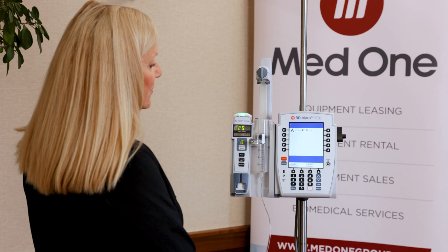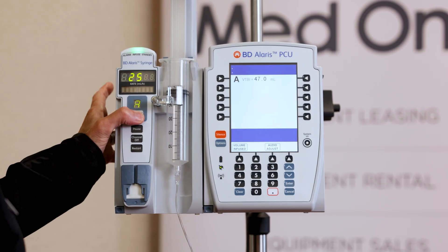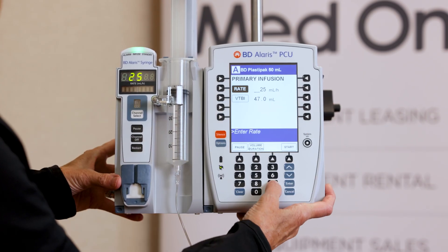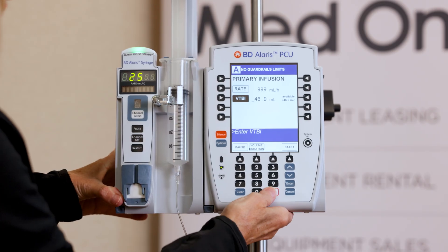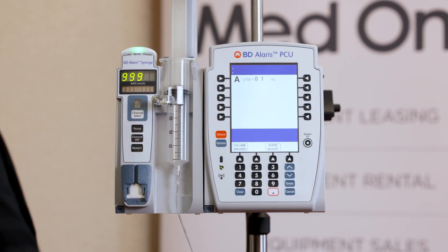Now I'm going to show you what happens when the syringe has emptied. I'm going to manipulate the numbers so that can happen pretty quickly — bump up the rate to 999 and take the volume to be infused down to 0.1, just to show you what happens when it's complete.